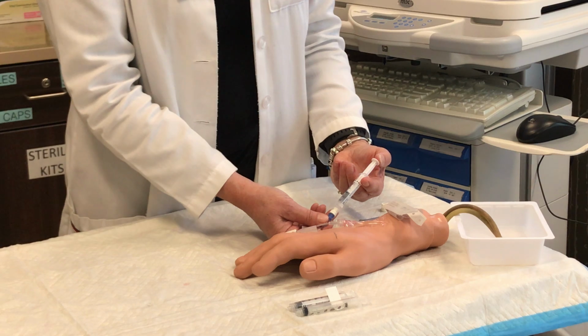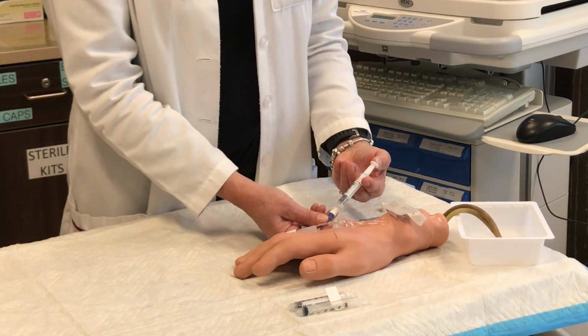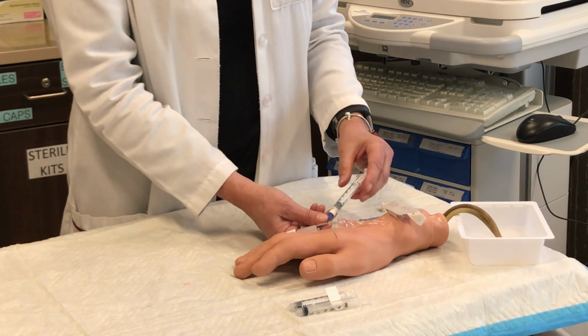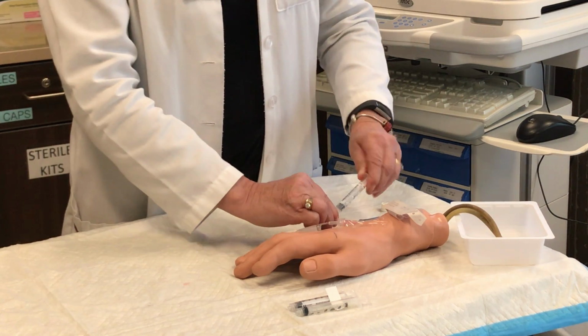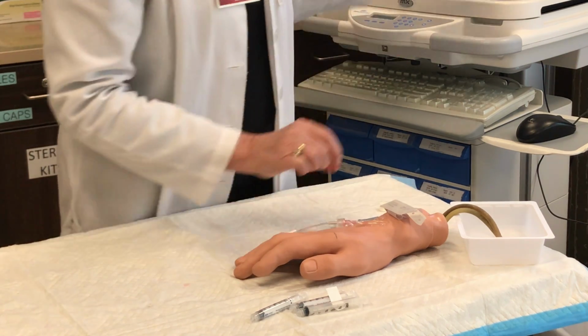Wait 30 seconds. And push my final 0.4 until I have 1 ml left. And now the second ml I'm going to push slowly, noting that the patient's not having any reaction or problems. Apply new swab cap to port.